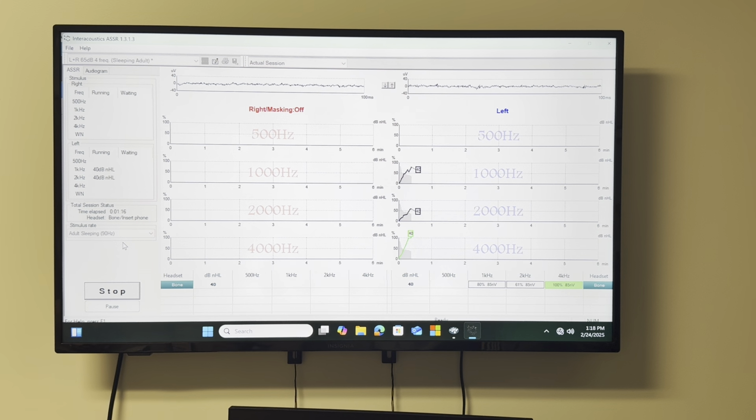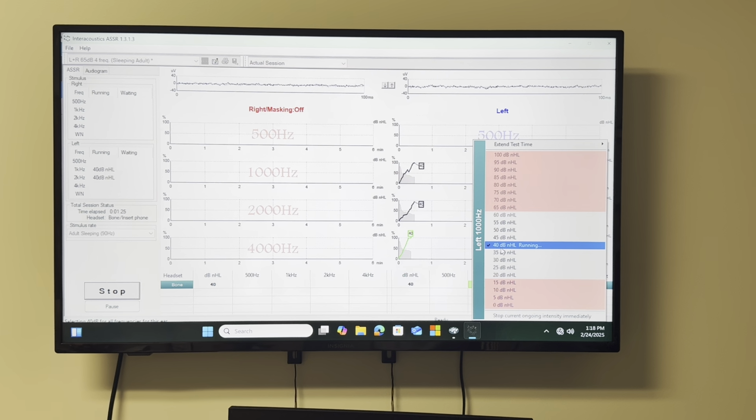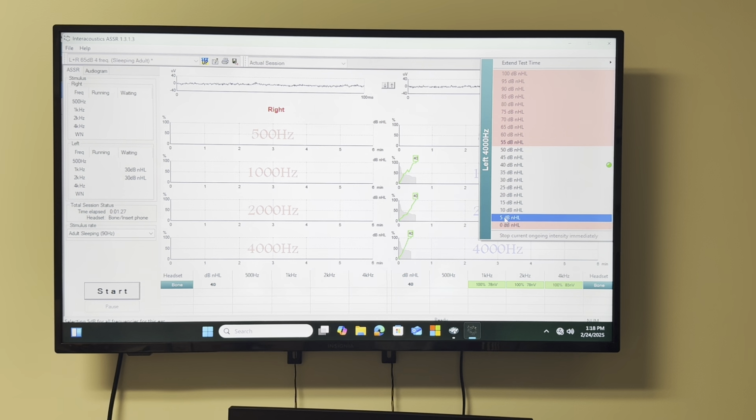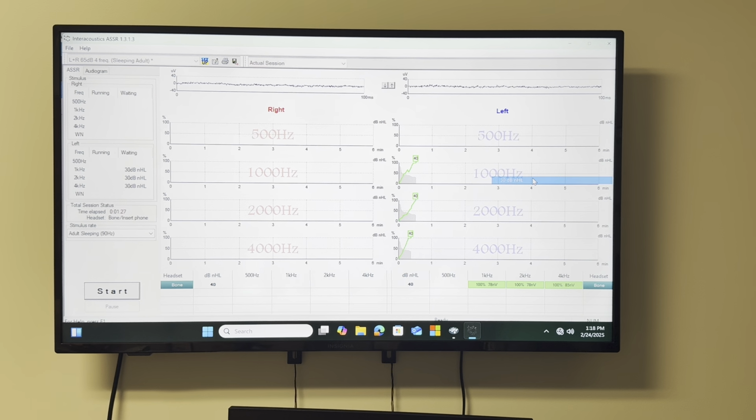It already reached, you can decrease it. See, the sound is being played in bone conduction, and you can hear that. Why is it? Even in your testing, you might have seen, when you're testing 2K, 4K, when you play 50, 60 dB, you can hear it through the microphone headset. Why is it? It's vibrating, it's moving. Even at 500 hertz it will move, but you don't hear it. Is it because of all of the frequencies?